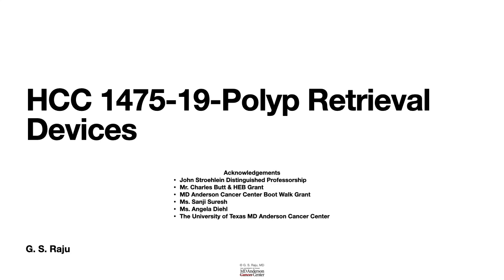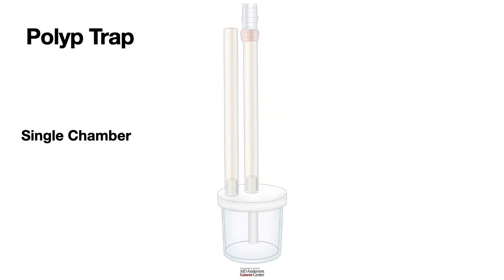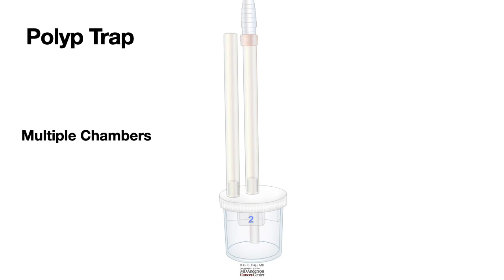Greetings. Let us learn about the polyp retrieval device, otherwise known as a polyp trap. This could be a single chamber polyp trap, or more often we use a polyp trap that has multiple chambers so that you could retrieve multiple polyps, each polyp into a different chamber.